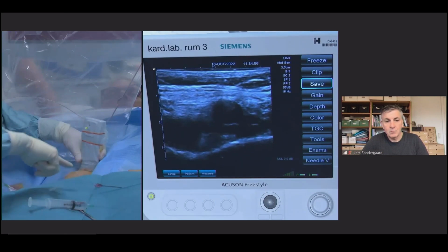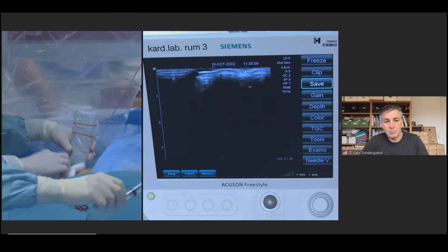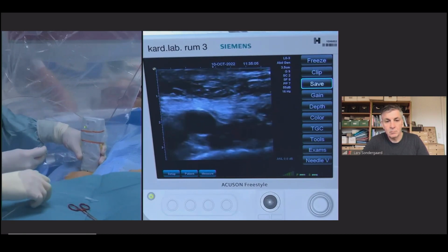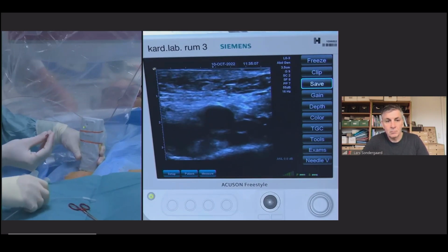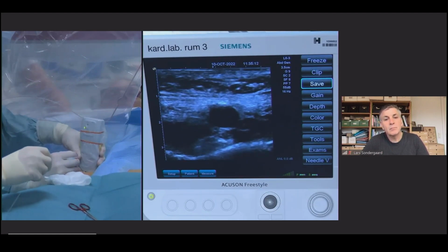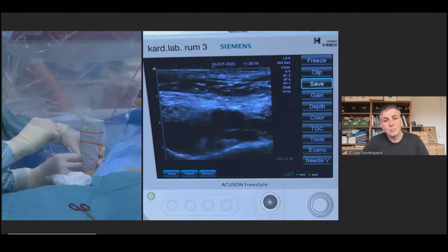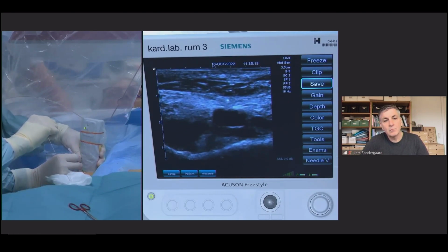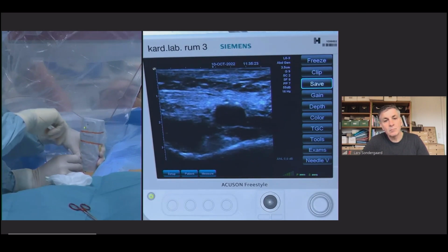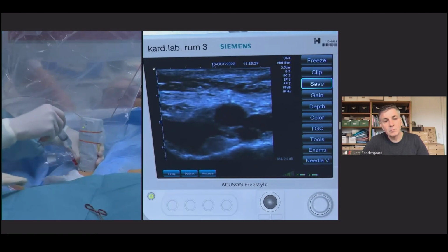And next, of course, doing the access here with a standard needle. Again, remember the patient is fully awake. There's only local anesthesia. There's no sedation for the patient. So, of course, good local anesthesia is really important here. And now you see the needle is coming down. You can see Ole is now just in the middle of the artery. So I think that's a good calcium-free position. And then you have the guide wire. So this is a way to do it nowadays.